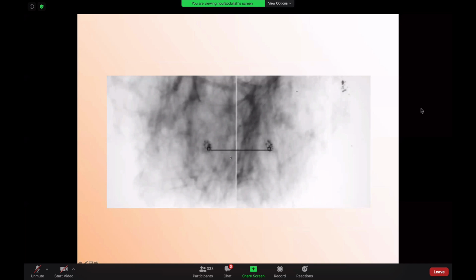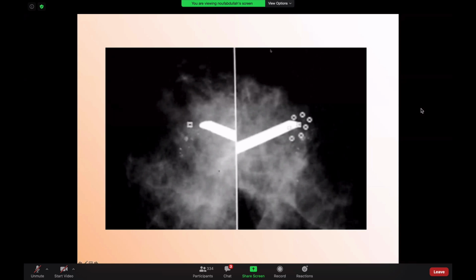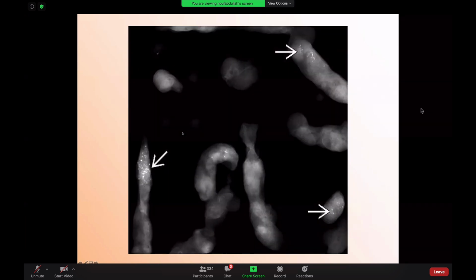So this is how it looks. In cases of microcalcification, the same thing. I will do 15 plus, 15 minus. I will put my X. The computer will calculate the location, and I will be able to do the biopsy. This is pre-firing. The needle is inside the breast already, before I fire it, and you can see the microcalcification, and then I will do the biopsy. Once you do the biopsy, this can come in the exam. So what is the name of this image?